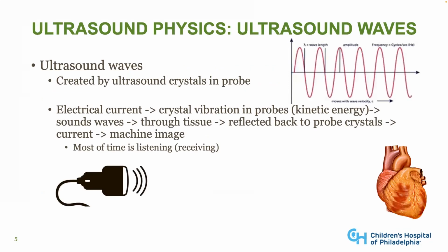As I'm sure many of you know, ultrasound physics really involves the physics of waves. Ultrasound waves are created by the ultrasound crystals in the probe, which emit sound waves at a specific wavelength.